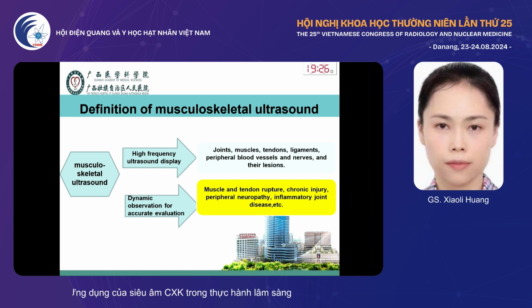Musculoskeletal ultrasound is the use of high-frequency ultrasound probes to examine joints, tendons, ligaments, peripheral nerves, and other structures.